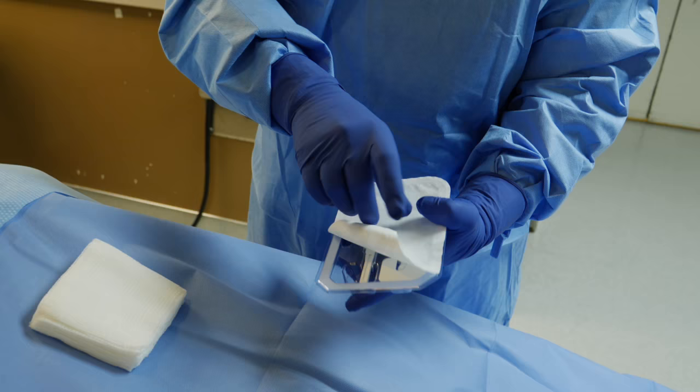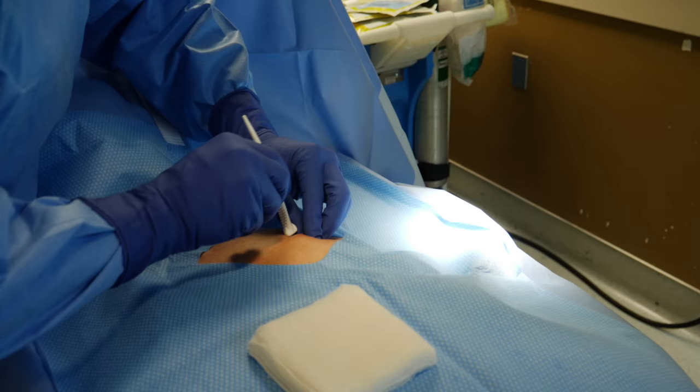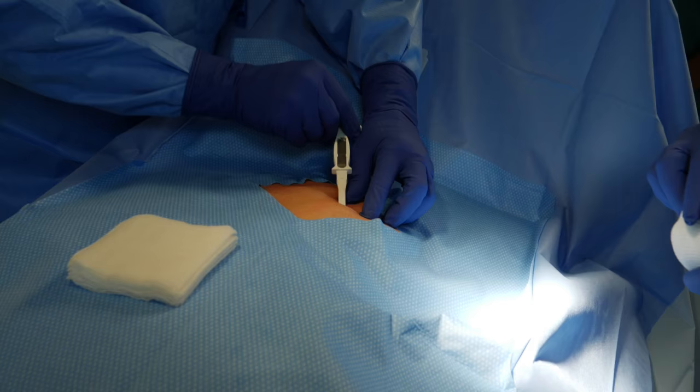Here is the insertion kit with the loop recorder, again supplied by St. Jude Medical. We take out the initial cutting tool that will create a track for us to insert the monitor. There we are making that initial incision under the skin with the specialized tool.